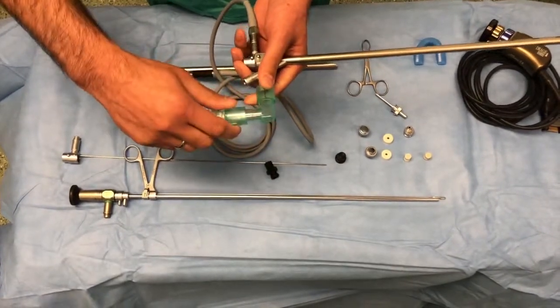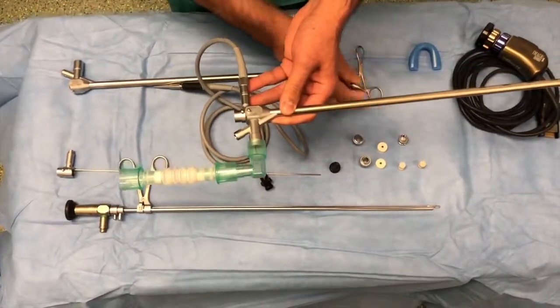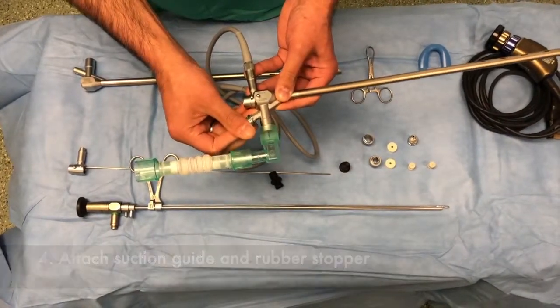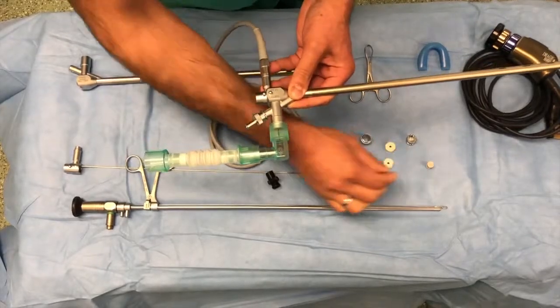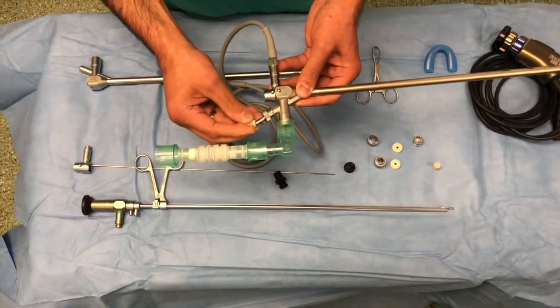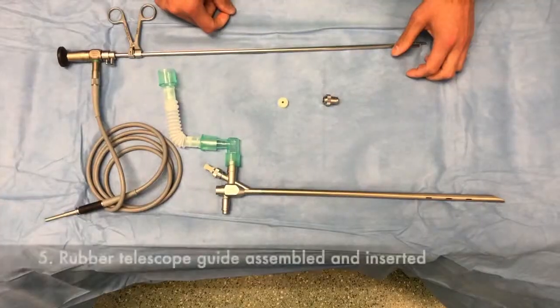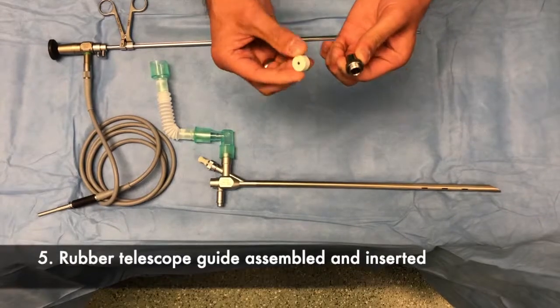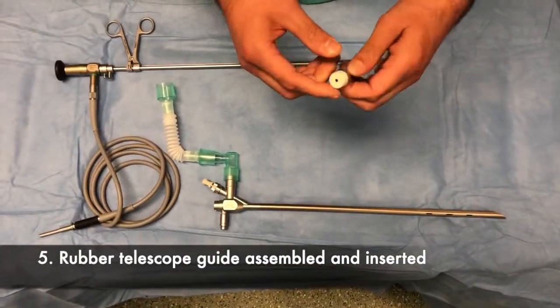Ventilation tubing is then attached as shown here. The suction guide and rubber stop is then inserted and clicked in place as shown here. The rubber bung is placed over the top to help avoid air leakage.